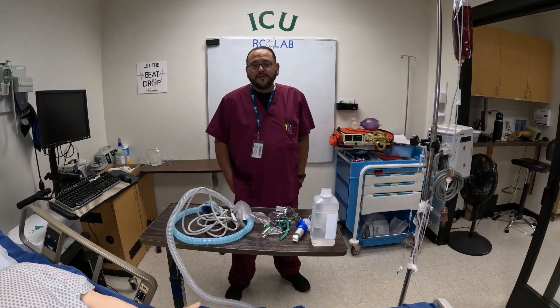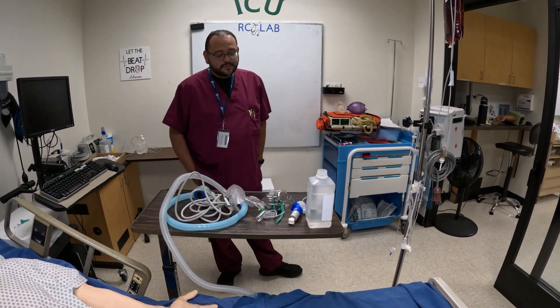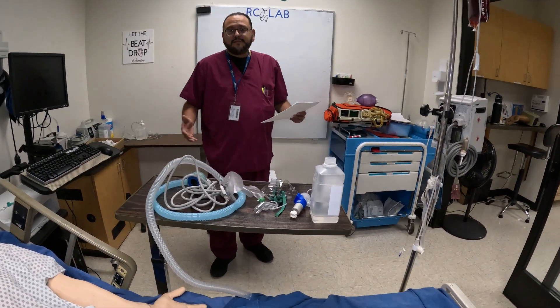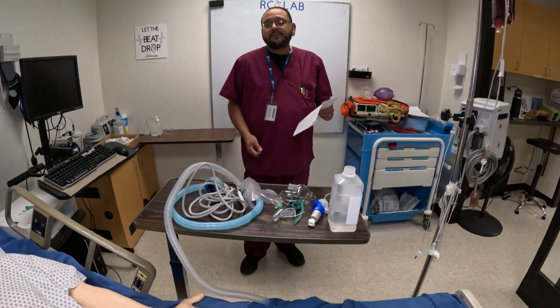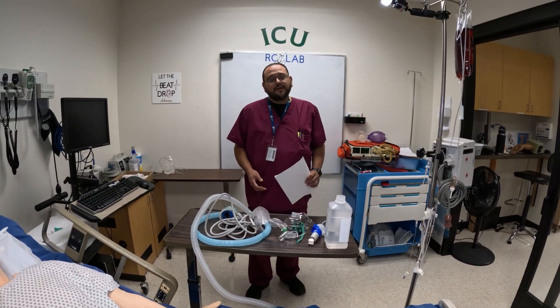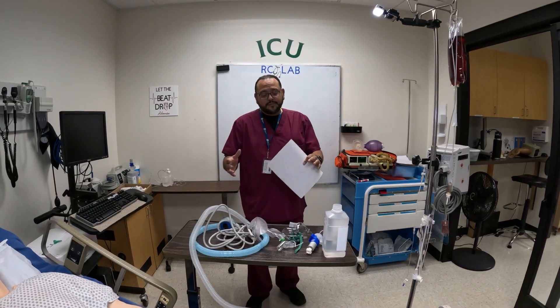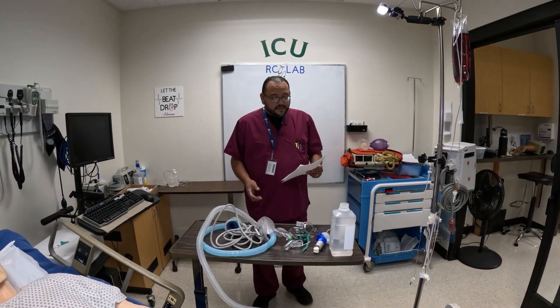Hello, I'm Harvey Olivia with Carrington College, clinical instructor here with the respiratory guy on the video camera. Today we're going to do our competency for humidity and aerosol therapy. Like anything we do, we have to verify physician's orders, so make sure you have a physician's order for this. After you check that, make sure you check the patient's chart, and before you enter the room put your proper PPE on — gloves, gown, whatever is necessary.